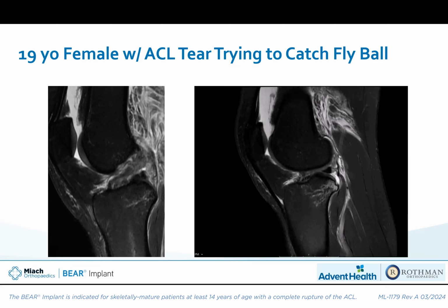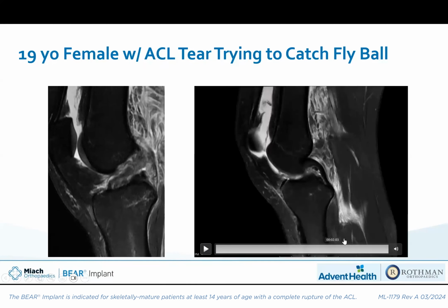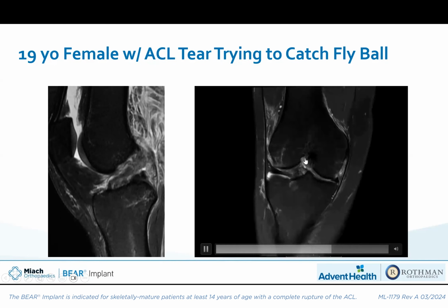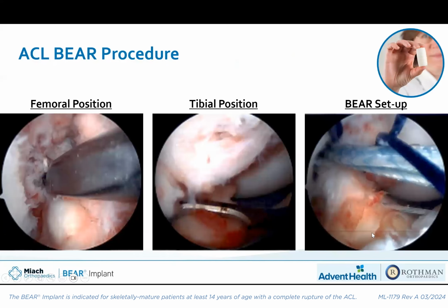And so as you can see here, definitely not a Sherman type 1 avulsion injury, some injury toward the mid-substance, but maybe a Sherman type 2, could be even up to a type 3 injury. We can see as we roll through the images here, a little bit of tissue attached to the femoral side. And we can see here on the coronal, we can still see a little bit of tissue on the femoral side. So definitely more of a type 2 to type 3 injury in a softball player at 19 years of age that plays in college. So obviously one of the athletes that some people might have concerns about, given that it's an elite athlete trying to play college sports.